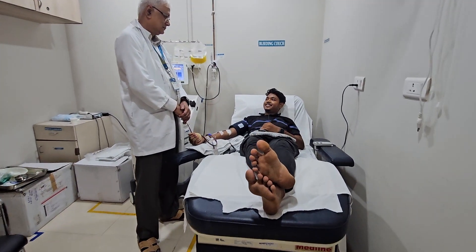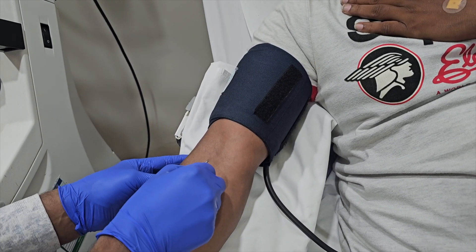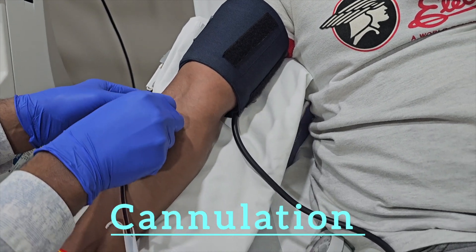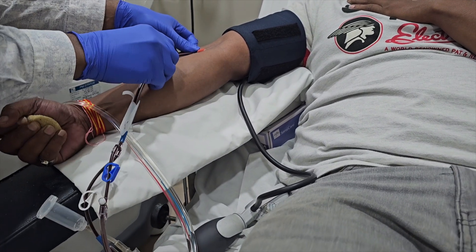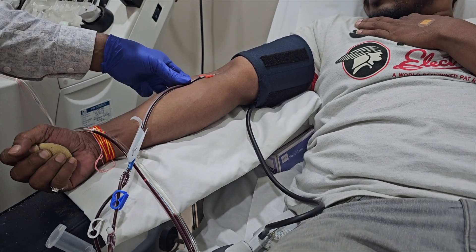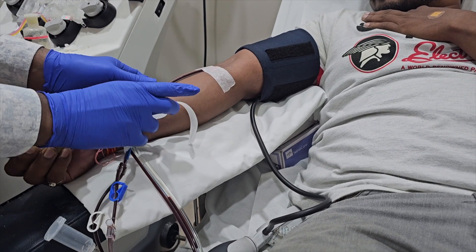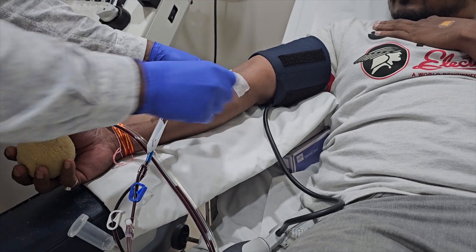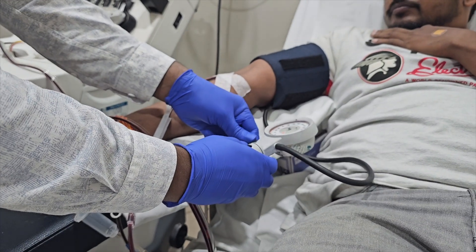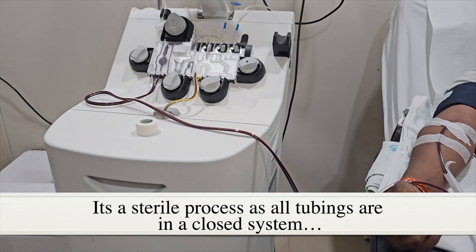Donor criteria for platelet donation needs to be checked. The process starts with single lumen vein cannulation, which is then connected to the apheresis machine with sterile disposable circuits. Everything takes place in a closed loop, thus sterility is maintained.